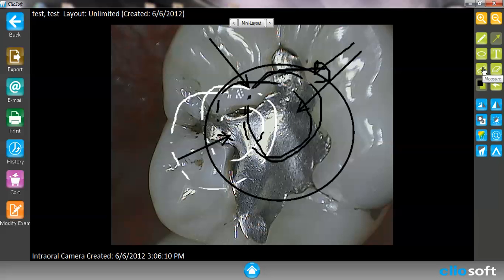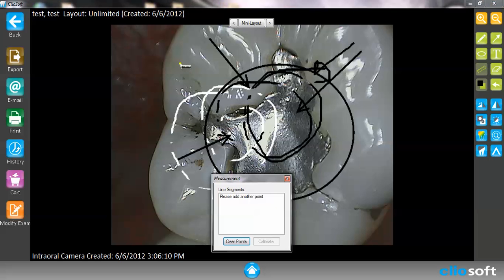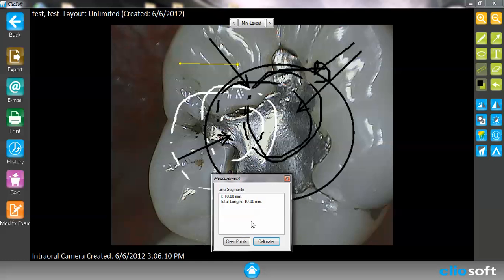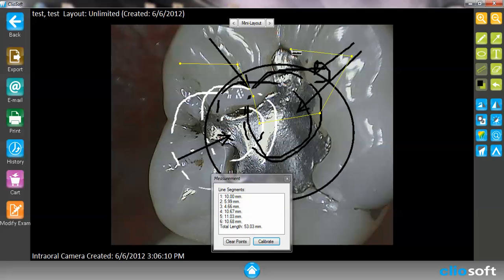We have a smart measurement tool. This is primarily used for digital x-rays where you would put in the first point and then calibrate it. After it's calibrated for the first time it will continue. So for example if I calibrate to 10, it's going to do the first measurement as 10 millimeters, and then for every point afterwards it's going to automatically calculate it for you.